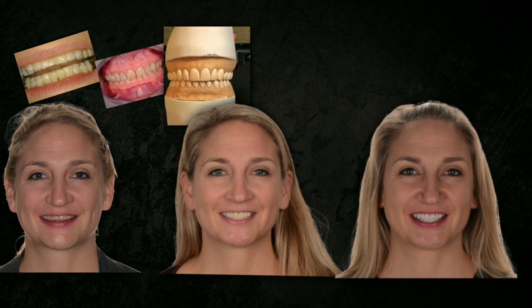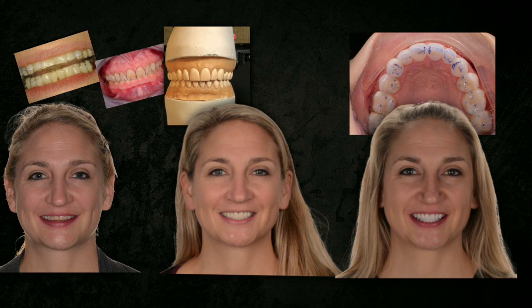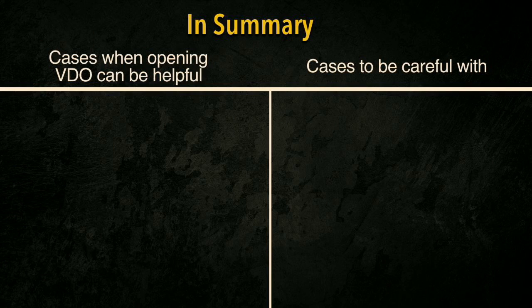We got her in provisional restorations. Dokonaliśmy jej odbudowy tymczasowe. We transitioned those provisional restorations into the permanent restorations. Po zaakceptowaniu zamieniliśmy je na prace docelowe. And then we dialed in her occlusion. I potem końcowa korekta szczegółowa okluzji.